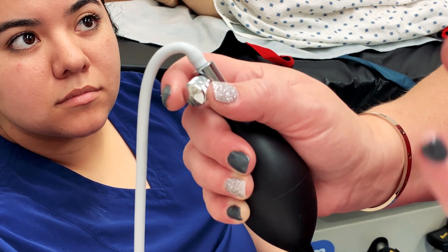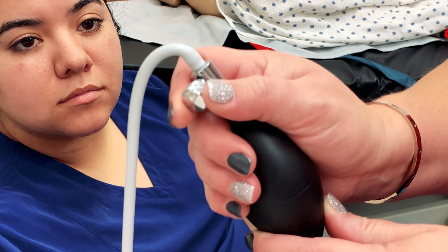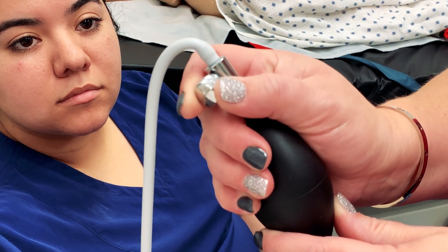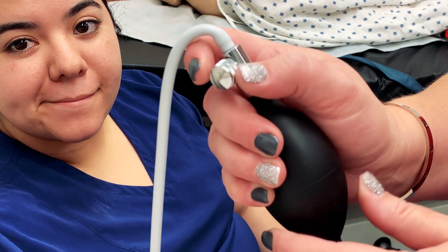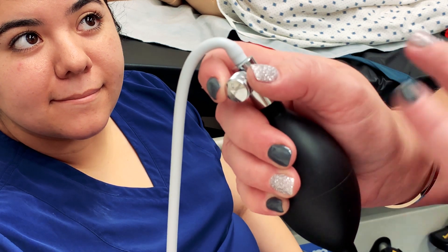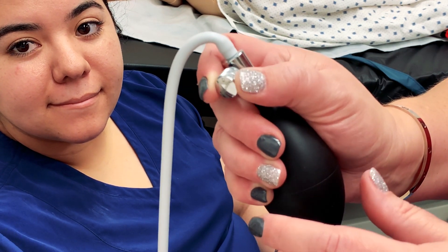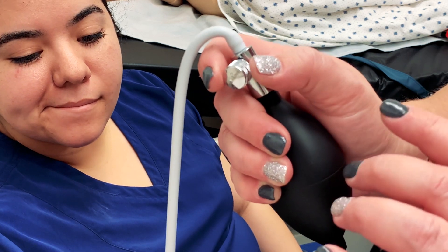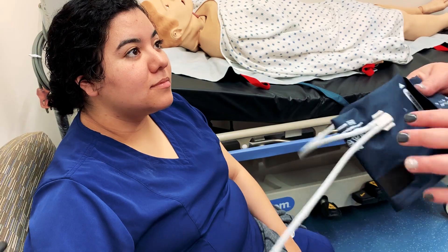Before you go trying to take blood pressures on your patient, you want to get really used to rolling this valve back and forth between your thumb and forefinger so that you get a feel for how fluid or how stiff that valve is — so you know how much to roll it when you're deflating the cuff.